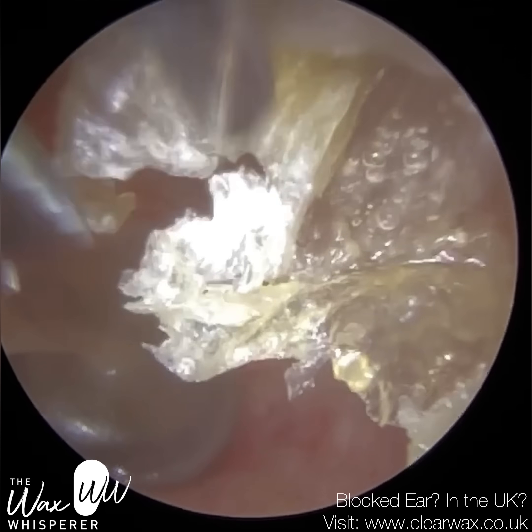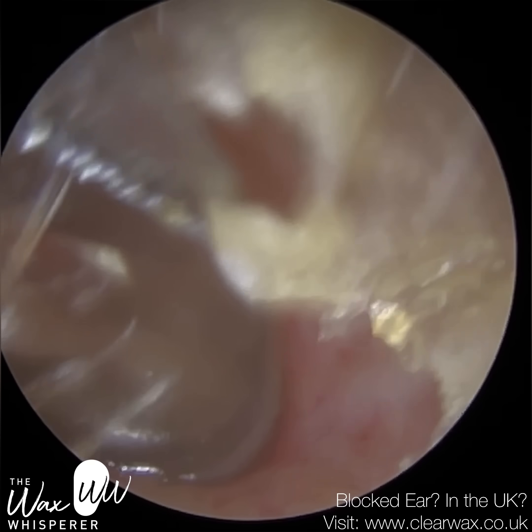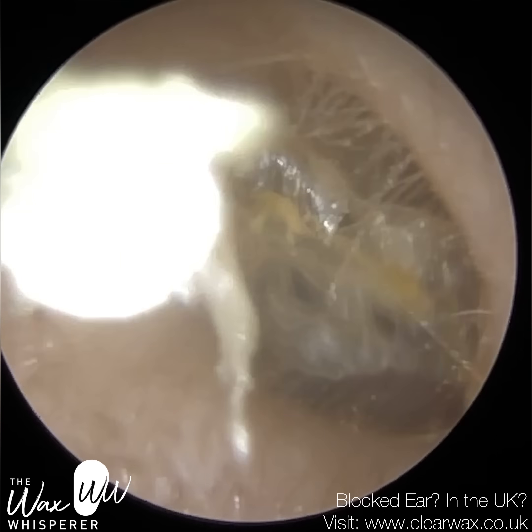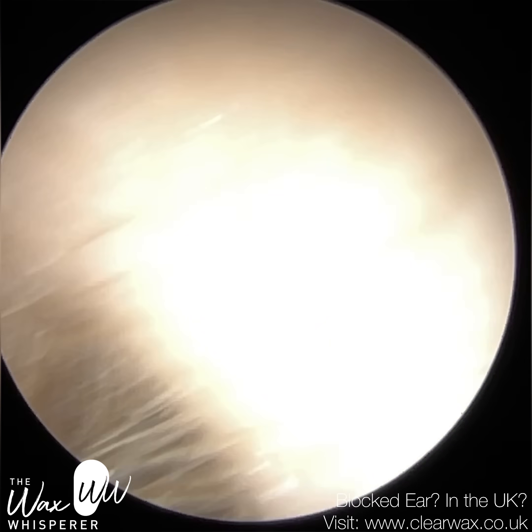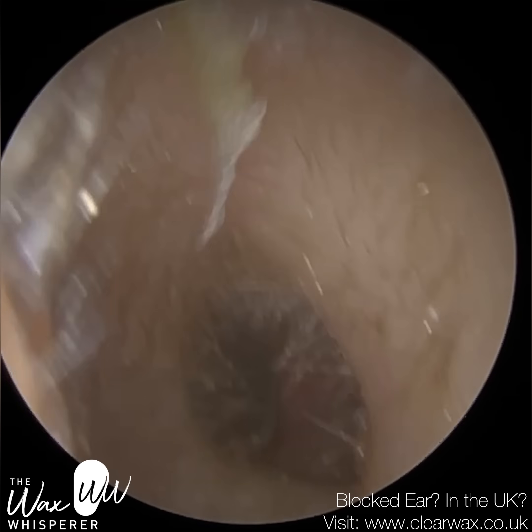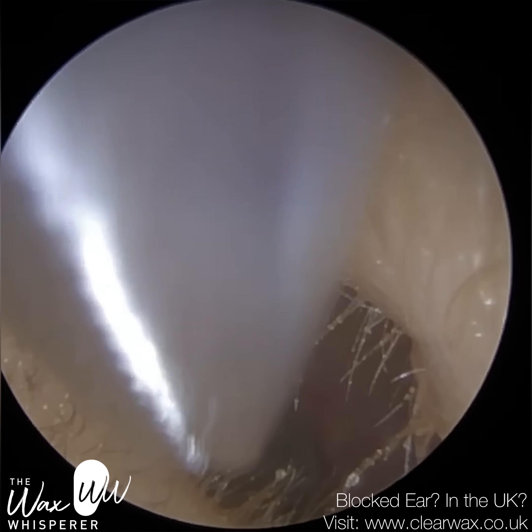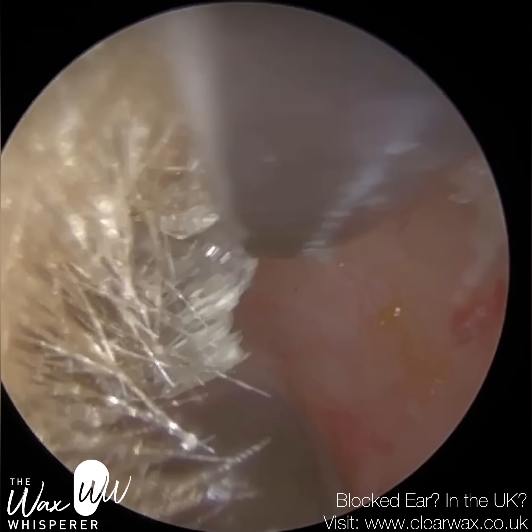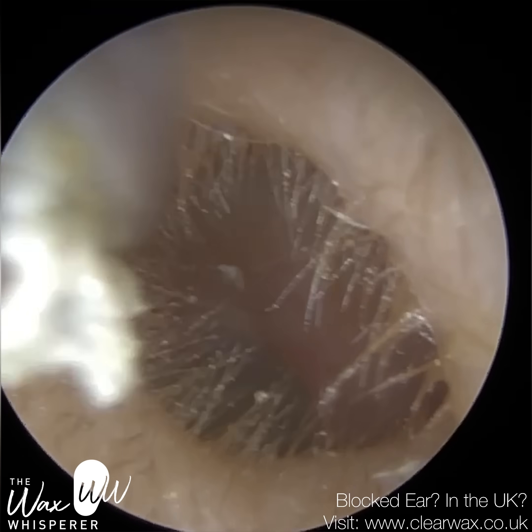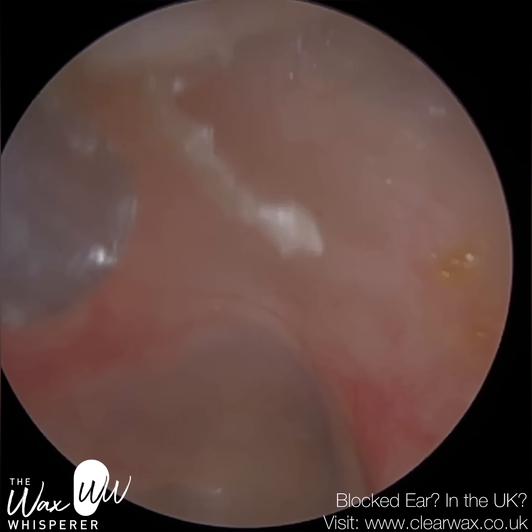This patient last attended four years ago and was supposed to come every year, but the patient didn't experience any symptoms up until recently, and of course we've had a pandemic in between. I've advised the patient that revisiting in 18 months or two years would be a good time to remove this dead skin. It was slightly uncomfortable today because the dead skin plug was so coarse and rough — almost like sandpaper. Because the ear canal has widened in the bony parts, the plug was greater in size and diameter than the entrance of the ear, so we really had to pull it through and the patient could feel the friction against the canal wall.